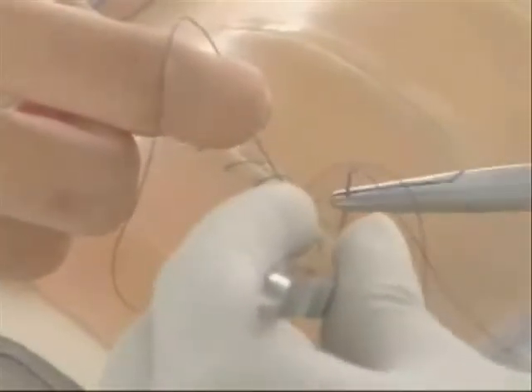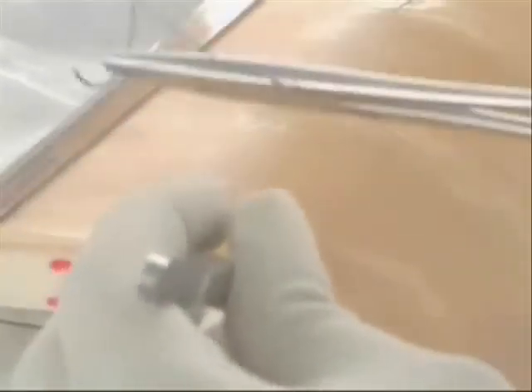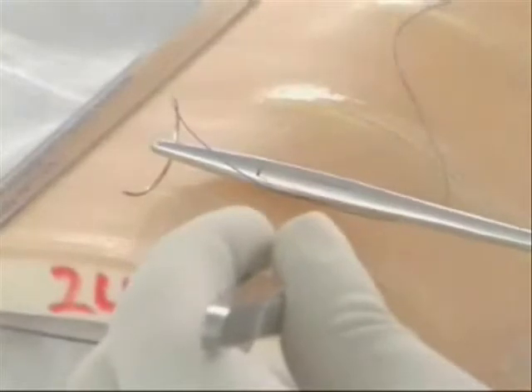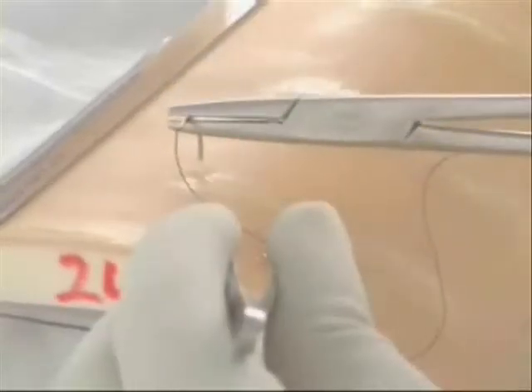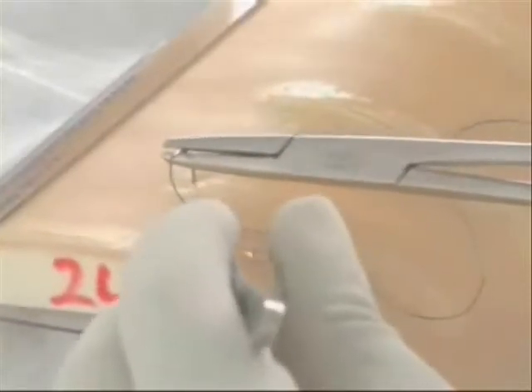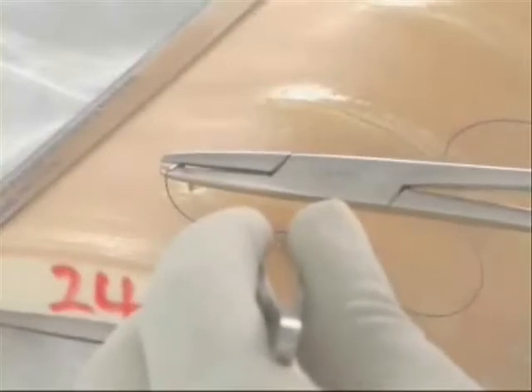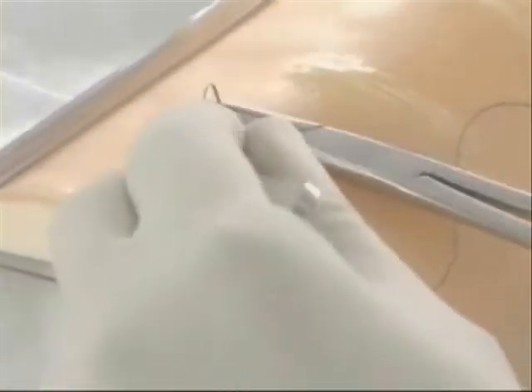You can decide what sort of sutures or appearance you want. Always go from away towards you — this is away towards you, not towards you, and going away. The needle must go perpendicular. You must allow the needle to penetrate on its own perpendicular; if you don't go perpendicular, no matter how sharp it is, it will not penetrate. Then I follow the curvature of the needle.